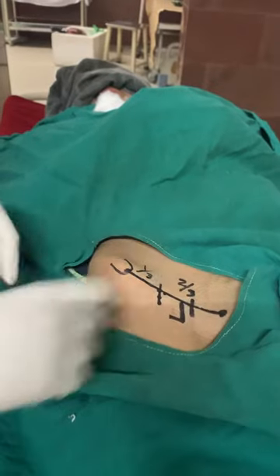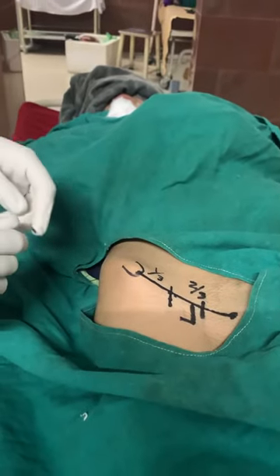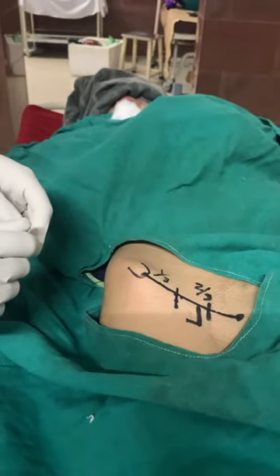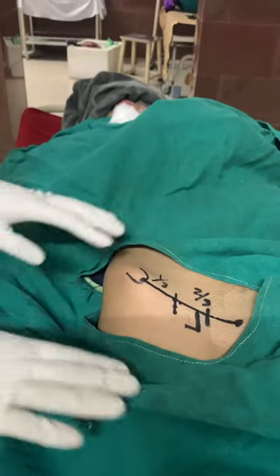This is a patient where we are planning a femoral nerve block and fascia iliaca compartment block by landmark-guided technique, using the loss of resistance technique.